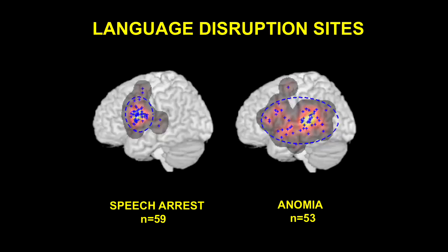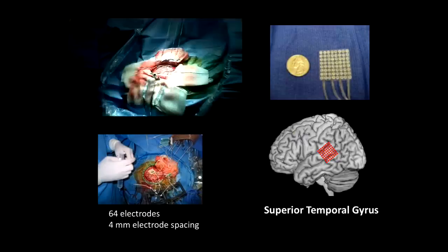So these are from different patients, right? These are lots of patients. And of course, when you have an individual patient mapped out, you're actually going to plan your surgical approach online so that you avoid these brain areas. It's really as straightforward as that, not trivial to implement, but done very well at most major neurosurgical centers. So here's an actual person being recorded.